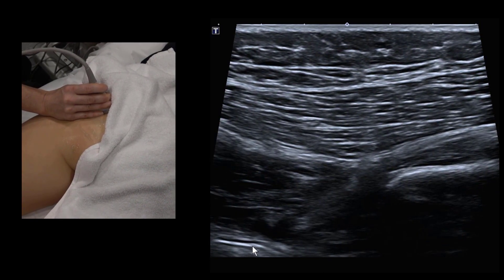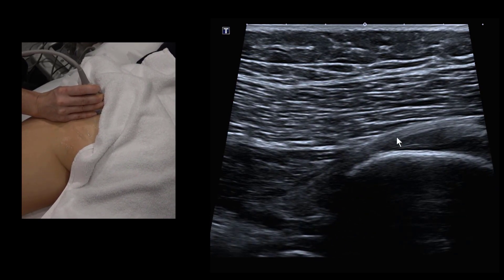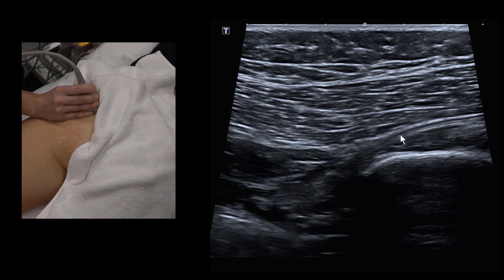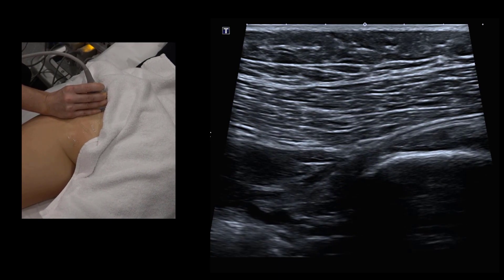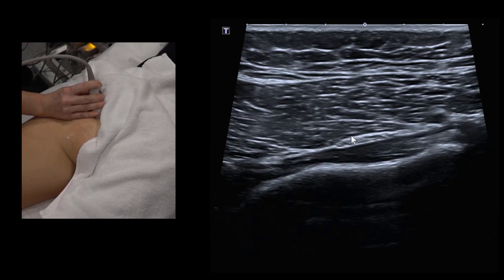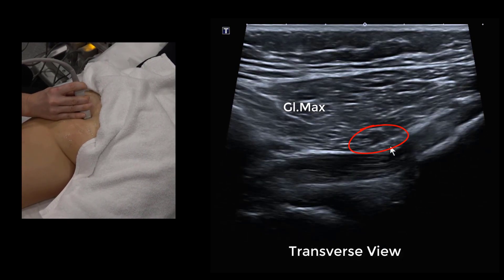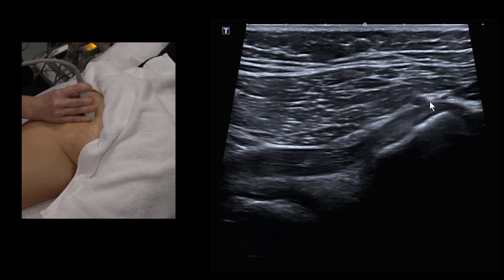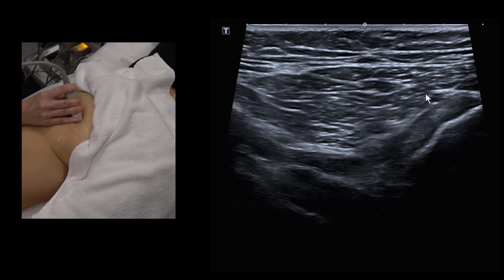Normal sciatic nerve anatomy: the nerve originates on the anterior surface of the piriformis deep in the pelvis, exits beneath the piriformis, then goes over the top of the superior gemelli. We may encounter anatomic variants — part of the nerve exiting through the muscle belly of piriformis, or originating superior to piriformis, or a high split into tibial and common peroneal components. The inferior gluteal artery is also visible here — important to note when performing hamstring injections.